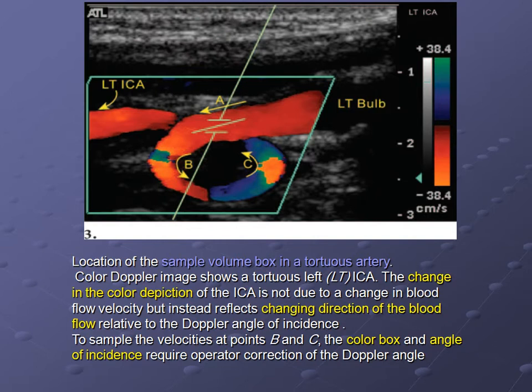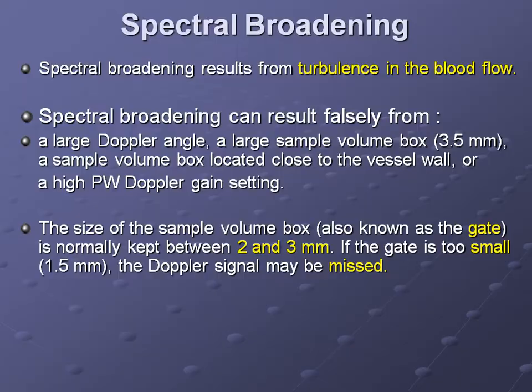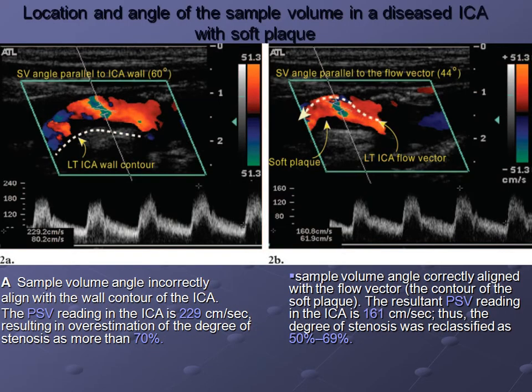Yeah, from 45 to 60, it's a big difference. 45 to 60 is very good. That's an example difference between the two. Exactly. 45 to 60 degrees. Okay? This is the peak systolic velocity.